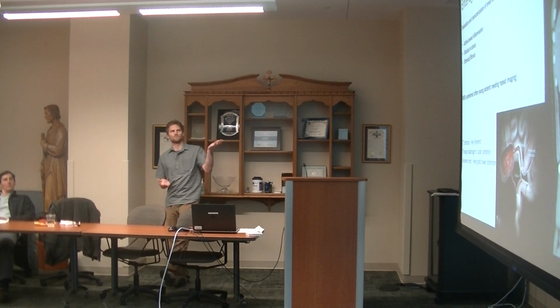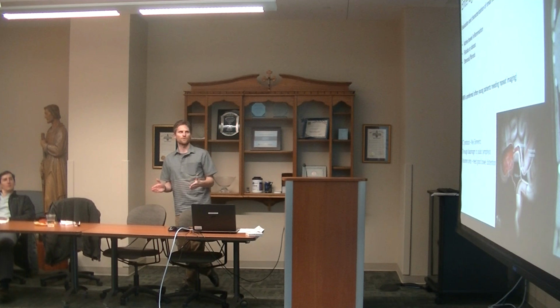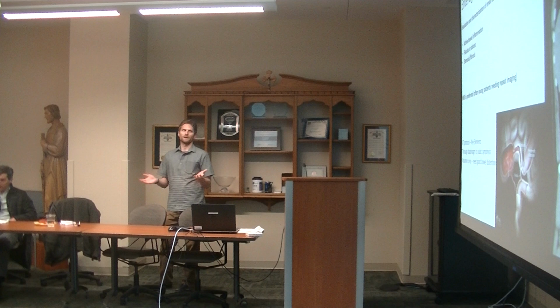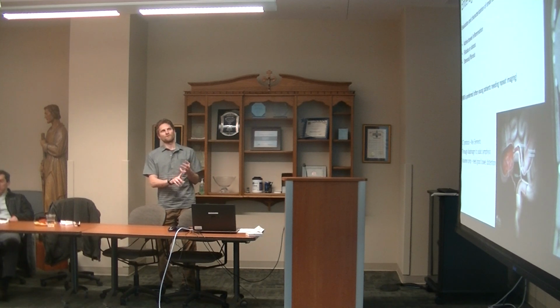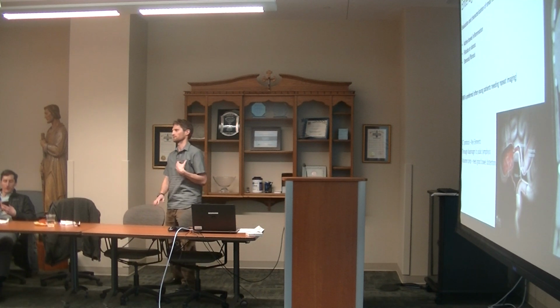So again, I just wanted to go over these multi-phase and specialized body exams, which are usually tailored to a specific question. So the indication should match up with the protocol, and if it doesn't, we don't want to be doing inappropriate imaging, so check with the radiologist to make sure we have the right protocol. And again, for a lot of these, except for the pancreatic adenocarcinoma and the adrenal mass, we're trying to shift the bulk of this work over to MRI.